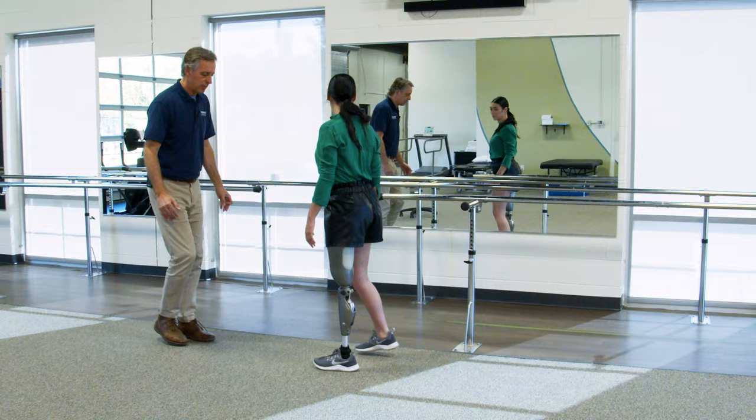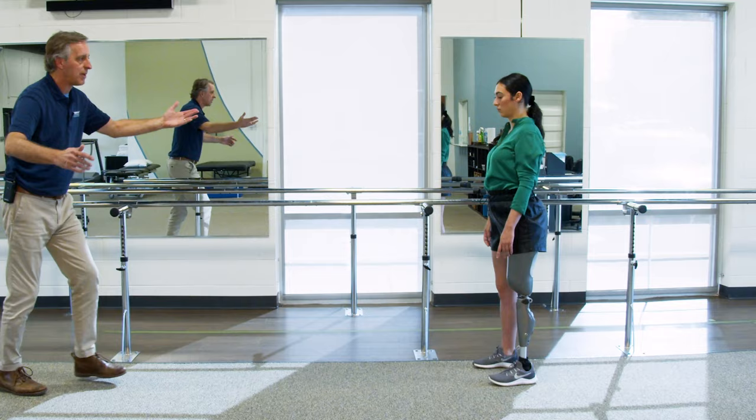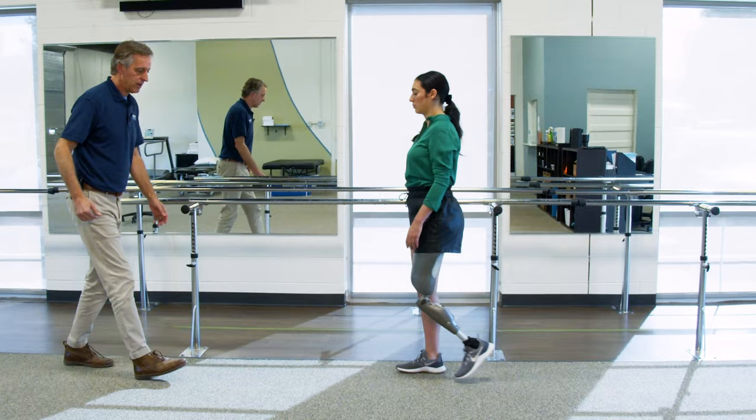That way she's always in a sense of control, keeps her weight forward, relax for a second. What that means is when she steps back on the prosthetic, she doesn't drop her weight into the heel and fall backwards. She steps back into the prosthetic foot, keeps her weight in the forefoot, which gives her stability as she steps back with her other foot. So that's your backstepping control mechanism. All right, then coming forward, excellent.